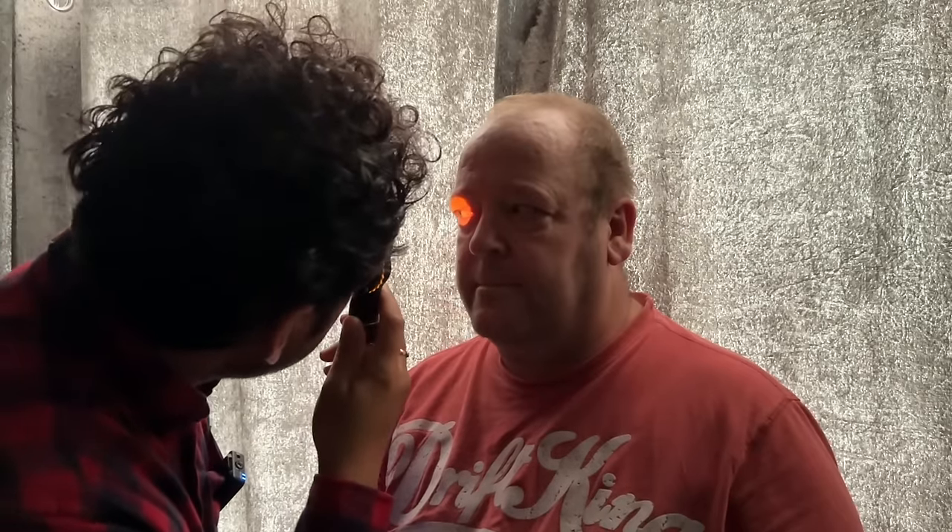Now I'm just going to have a little look at the iris of the eye — that's the coloured part. And then just come back a little bit to check for any potential loss of transparency as a result of any corneal issues. If you just move left and right, sometimes if you do see an opacity, you can check whether that's on the cornea or the lens. And then for the crystalline lens, come a little closer still. Look left, look right, checking for any opacities.